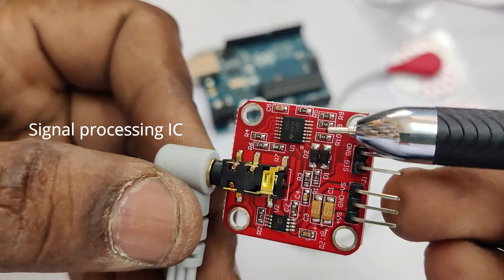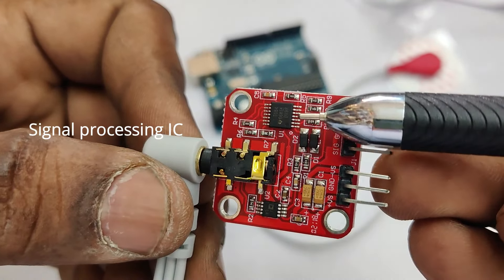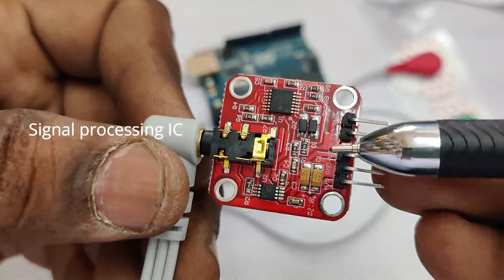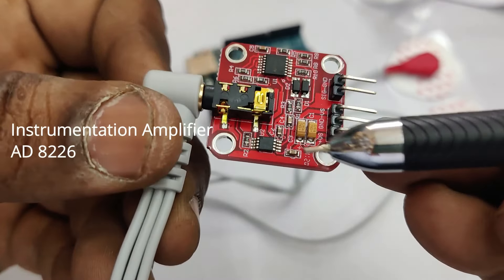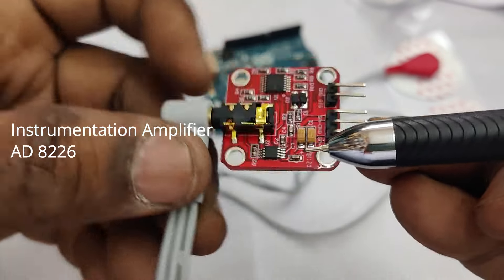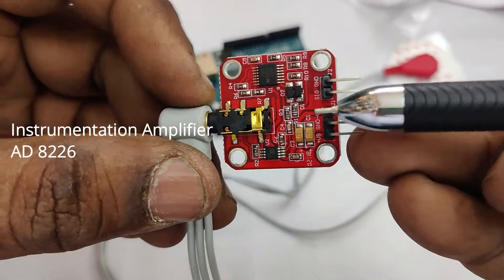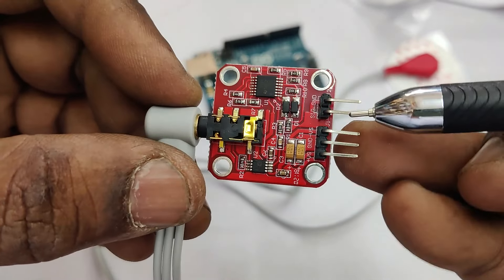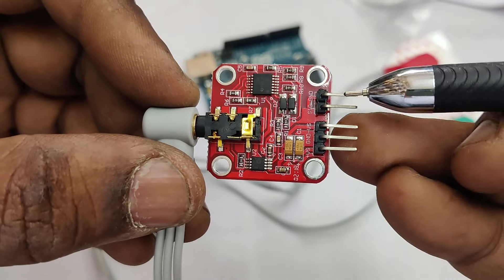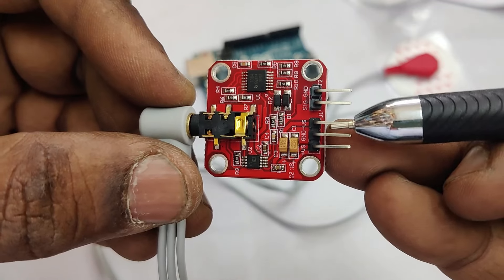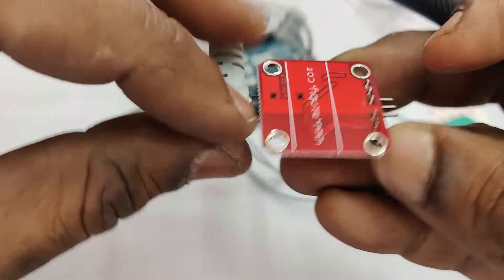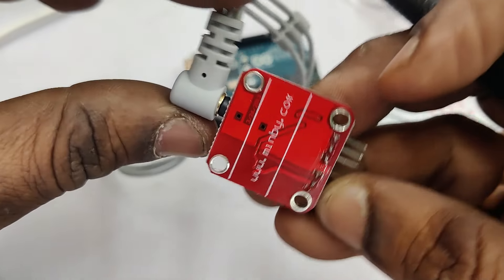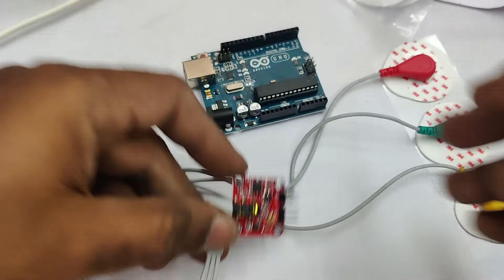The board has got a signal amplifier, signal processing IC, and then an instrumentation amplifier, mostly it is AD8226 which produces an amplification factor up to 1000. It has got signal pins and power source pins. It requires dual power source.